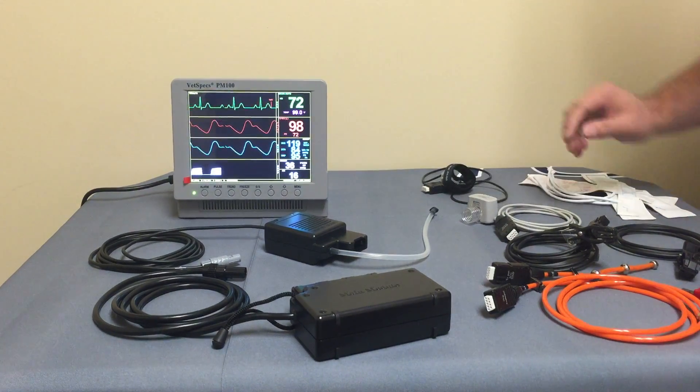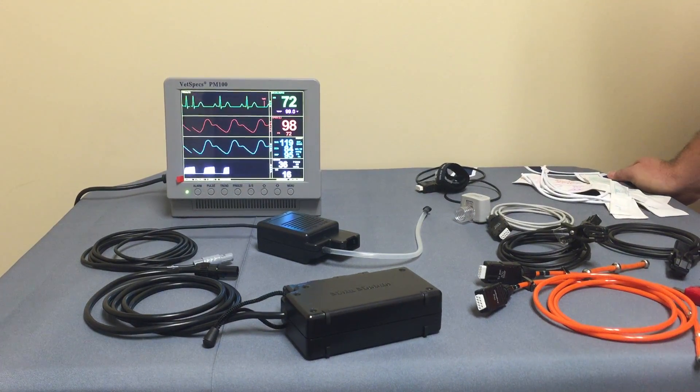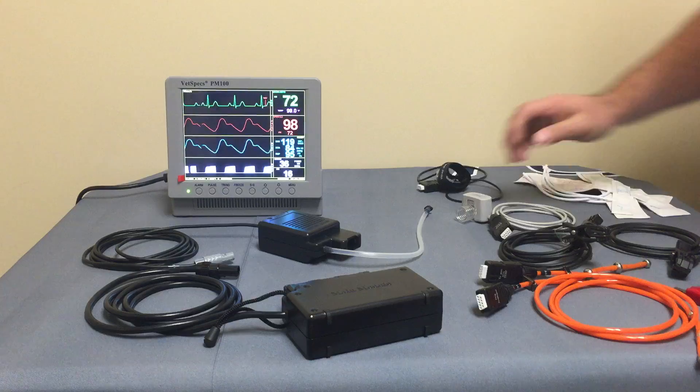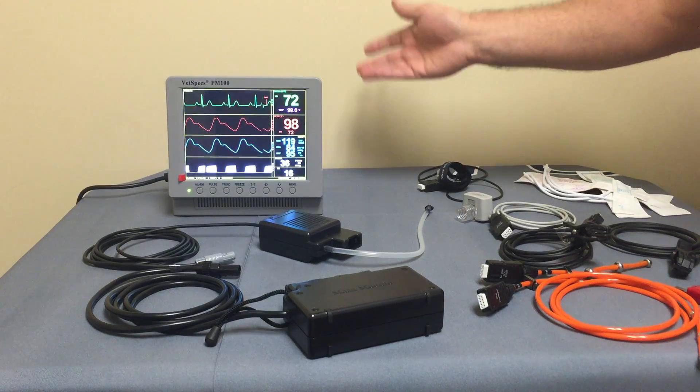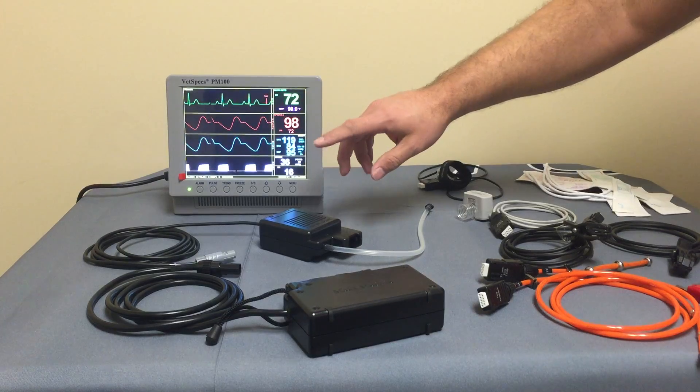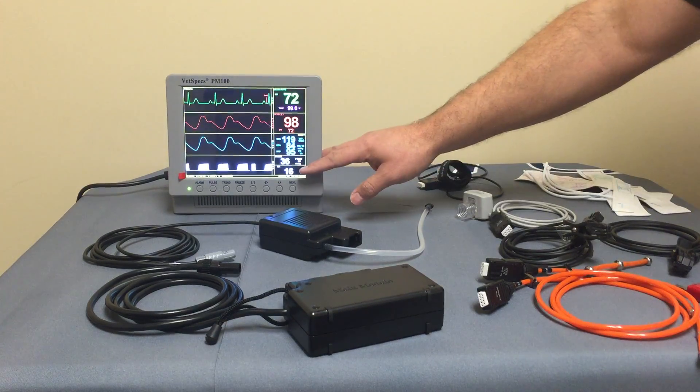Here we have the Vetspex PM100 surgical monitor. The PM100 is their flagship system, giving you essentially all the monitoring functions you can get in a modern day system with ECG, pulse ox, blood pressure, and capnography.